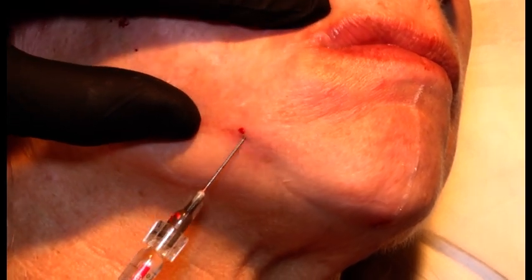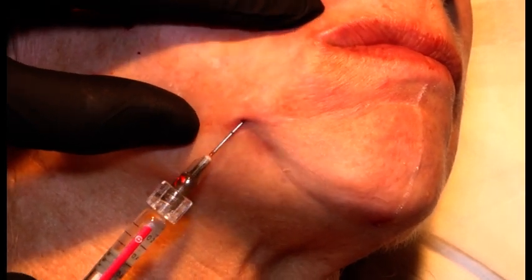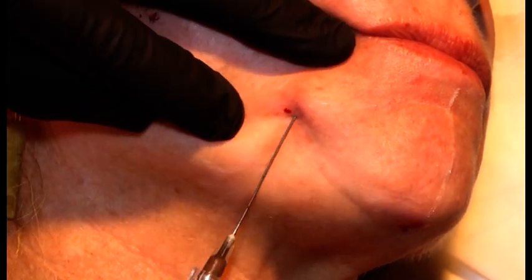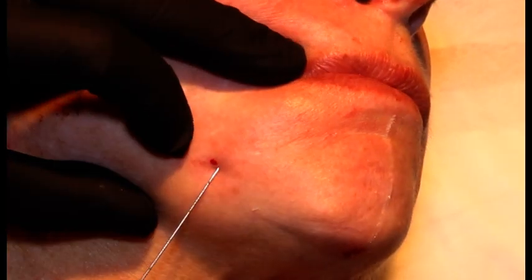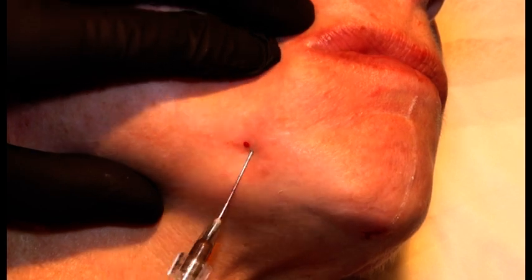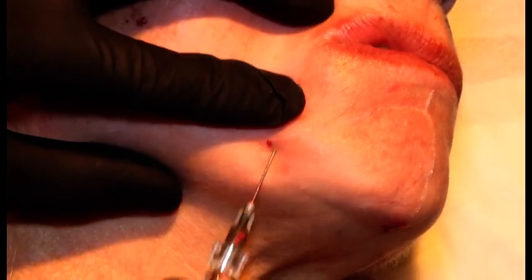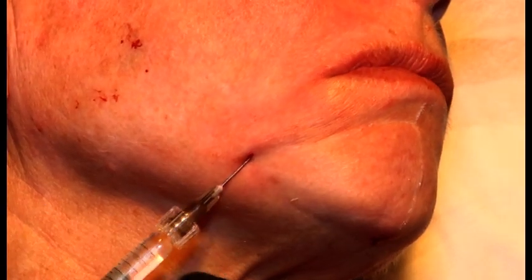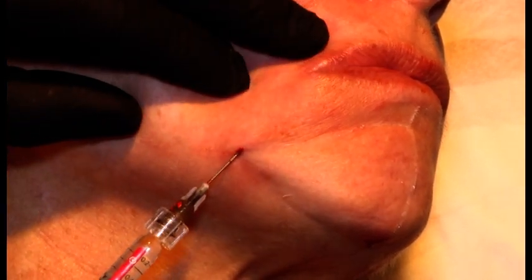Giving a little bit of anesthesia, and also, you see the cannula, wait, I have to go a little bit more superficial so you can see better. If I want to go more superficial, I just push the syringe down in order to get the cannula to stick up against the skin. And I can even go just a little bit into the upper vermilion border.